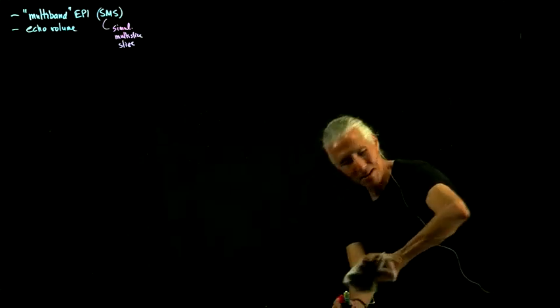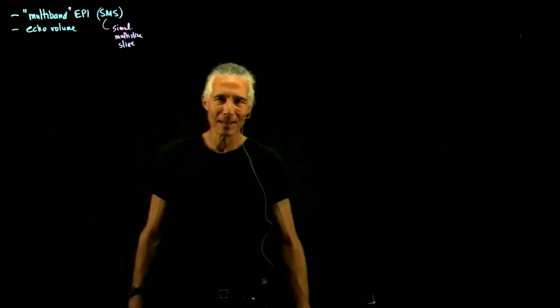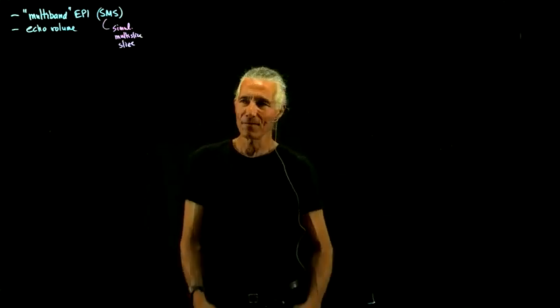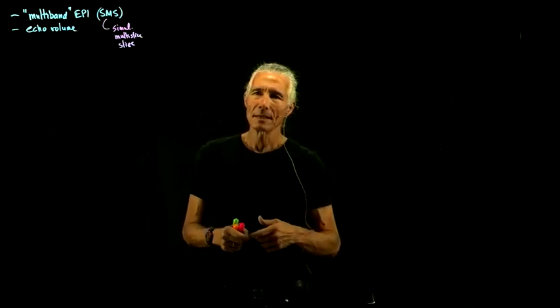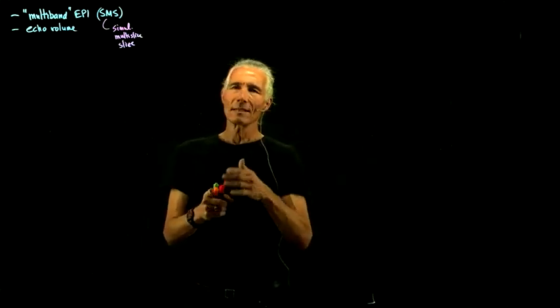So now, why do you want to do this? Why does everybody do this? Well, you get 4 times as many slices per second. So who wouldn't want to do that? You get 4 times as much data. Literally, it just quadrupled your data with almost no cost. So you can do more slices. You can do slices more rapidly.